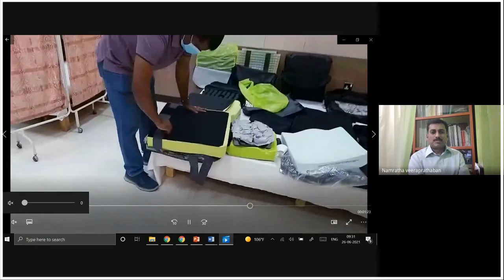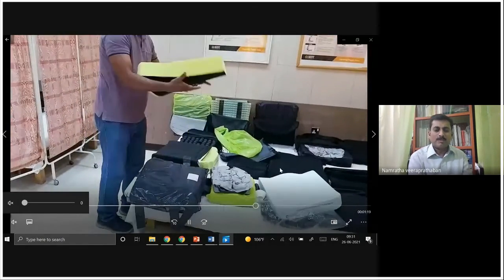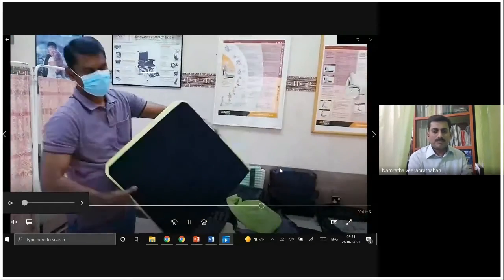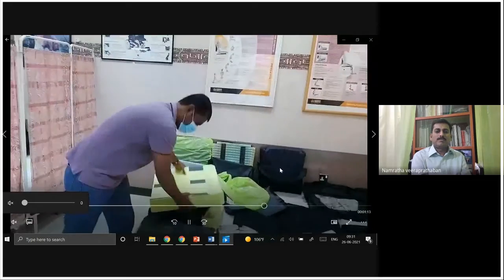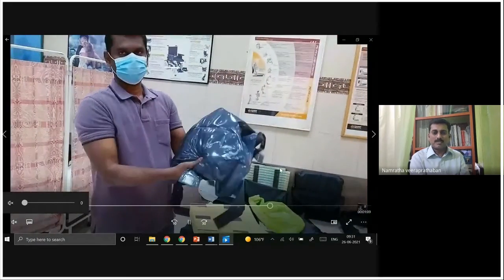Each type of cushion has its own clinical value. You cannot recommend a gel cushion for everyone, or gel with foam cushion for everyone. Proper assessment is needed, and this type of memory foam with gel cushion will really suit patients who are at risk of skin breakdown.